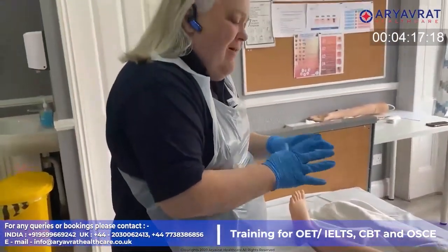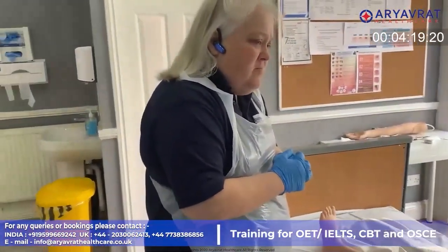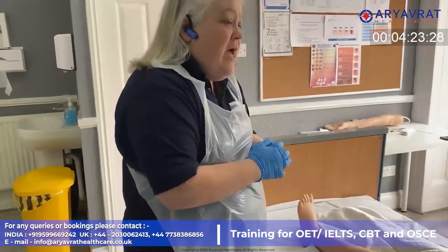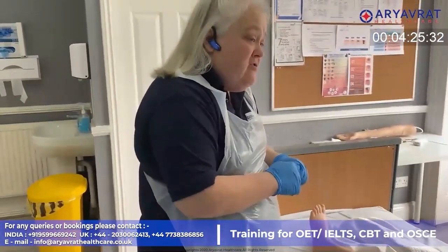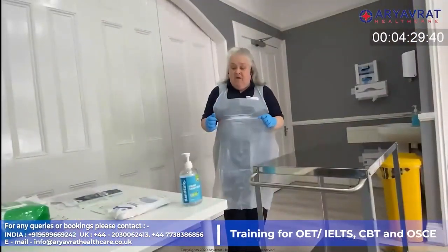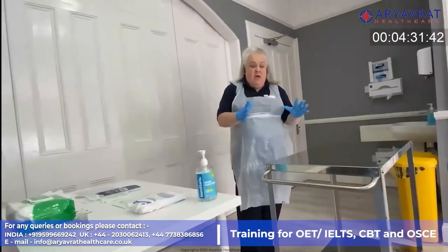Okay, lovely. Have you had any painkillers this morning, Raj? Yes, I think that I had some. Okay, are you happy for us to proceed and get the dressing done? Yes, please go ahead.